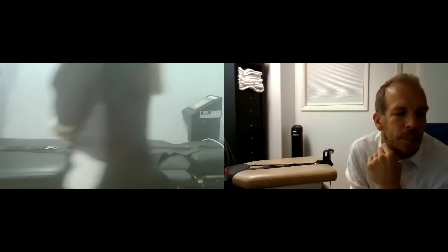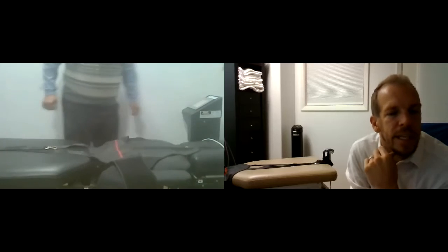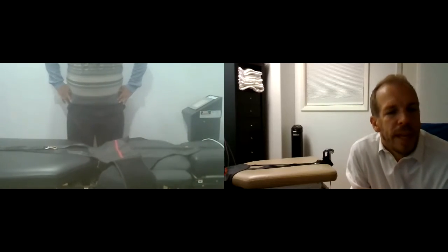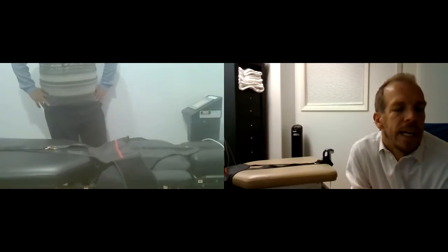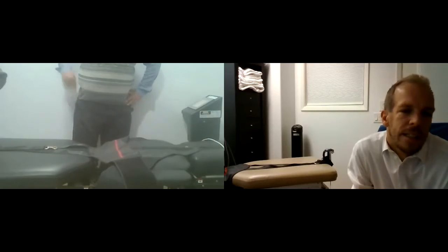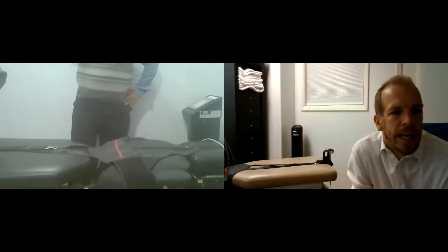So the point is that you want to treat patients in the position that brings them relief or centralization of their symptoms. So if they have shooting pain down the leg, numbness, or tingling, you want to put them in the position that brings that up out of the foot and the leg into the spine.